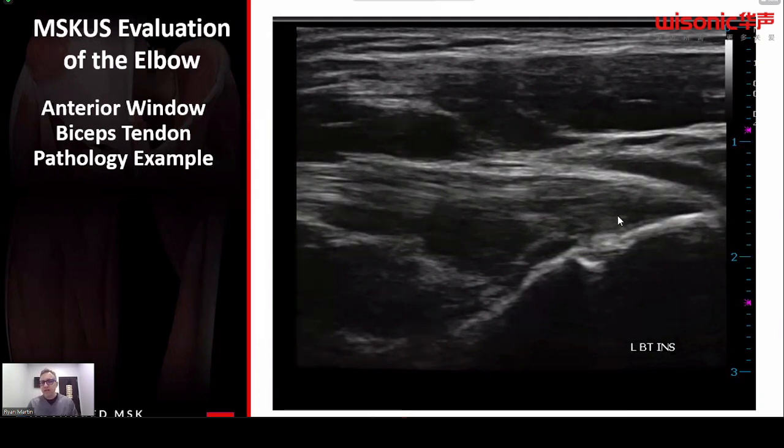In this one here, it's tendinopathy. You can see these fibers. They don't look as consistent. So if you look at this proximal side here, those fibers look very consistent. And as you work your way down, they start to decrease in the shape and the integrity. And then as you get through here, you see that there's this undersurface tear, and these fibers don't look as homogeneous or consistent. So to me, if I looked at this one here, if I didn't have a history, this almost looks as if it would be an acute on chronic type of scenario.